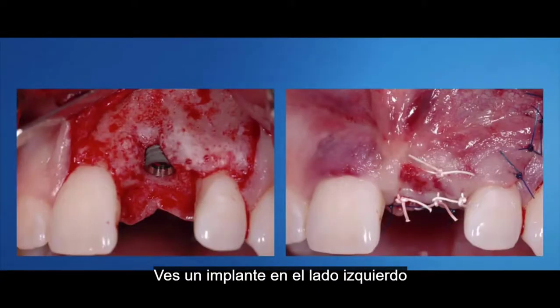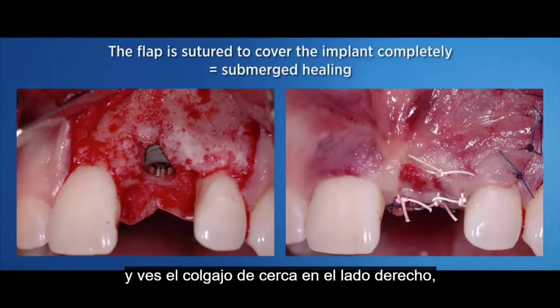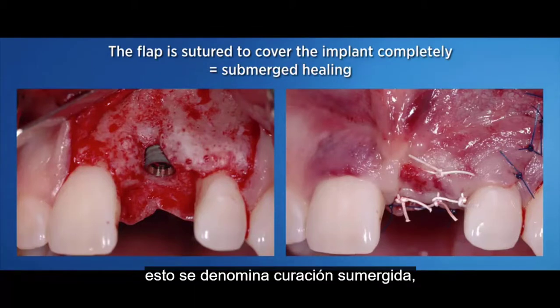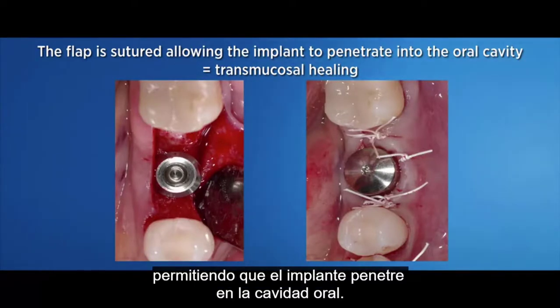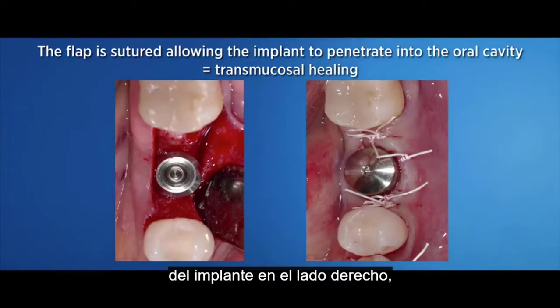You see an implant on the left side, and you see the flap closed at the right side. And here the flap is sutured to cover the implant completely. This is termed submerged healing. So the implant is submerged underneath the soft tissues. Here the flap is sutured, allowing the implant to penetrate into the oral cavity. You see the flap raised on the left side, and you see the flap adapted around the neck of the implant on the right side. This is called transmucosal healing.